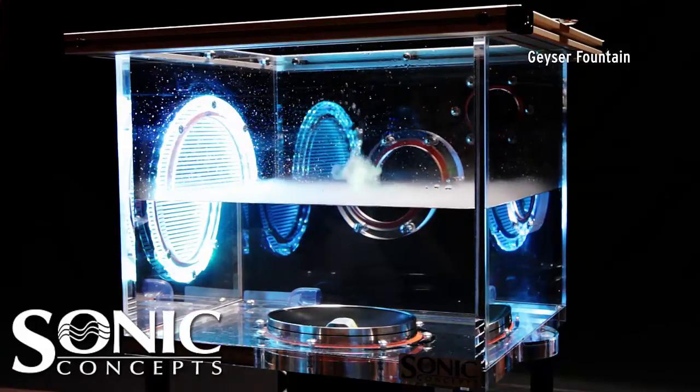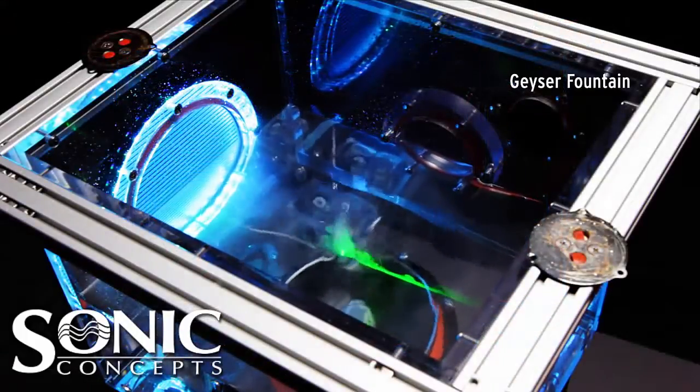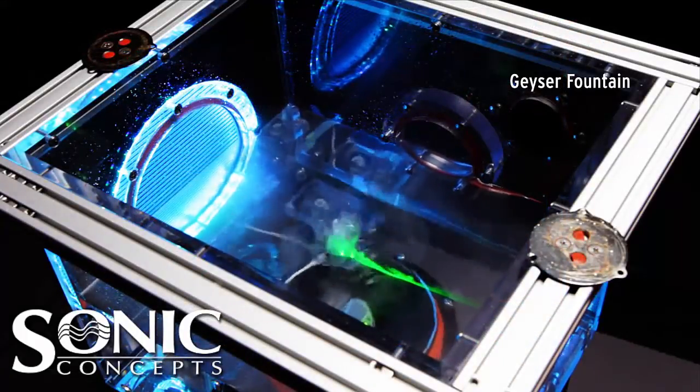A bird's-eye view reveals accumulation of fog above the water level. The intense focus is seen ejecting large water droplets.